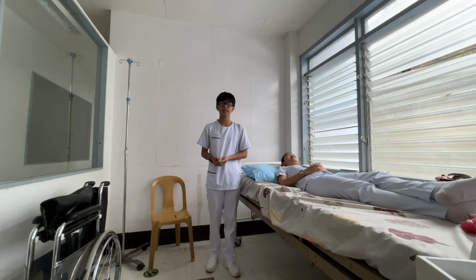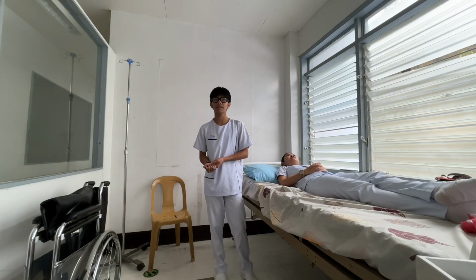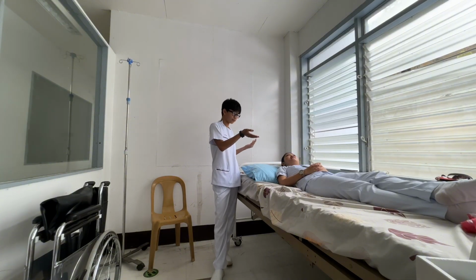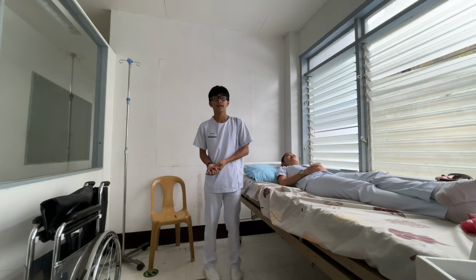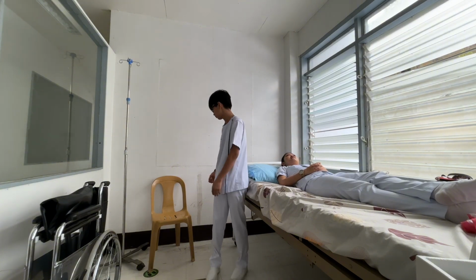Next is always predetermine the number of staff required to safely transfer a patient horizontally. So as in my case, my patient is capable with my size, so I alone will assist the patient. Next is, if needed, move the furniture and equipment to make room for the wheelchair.